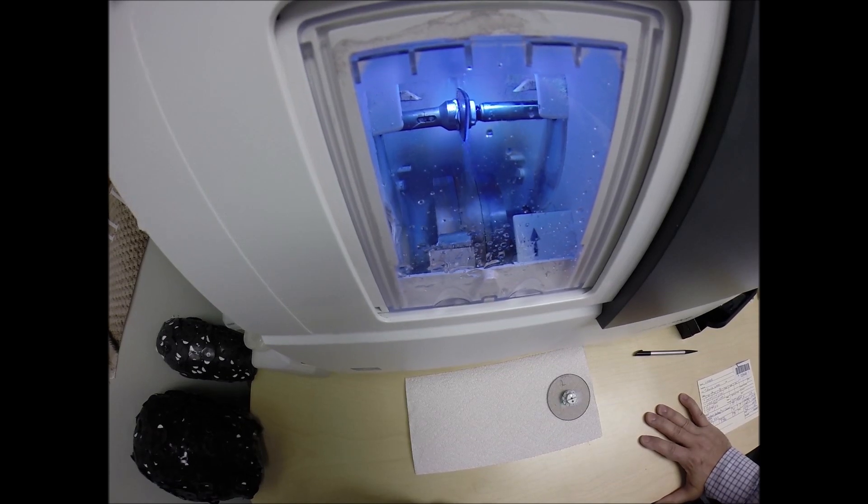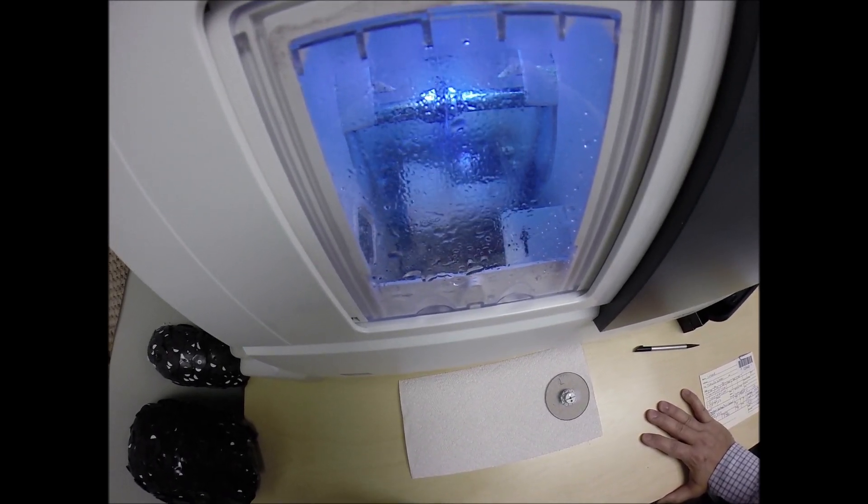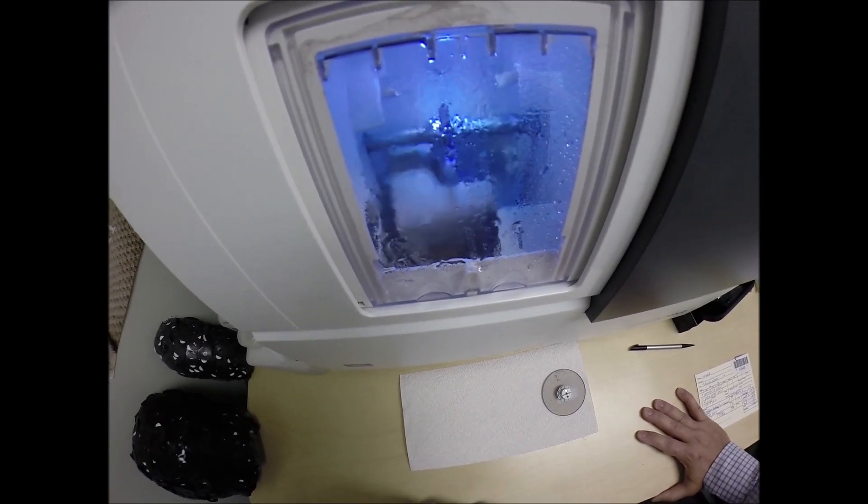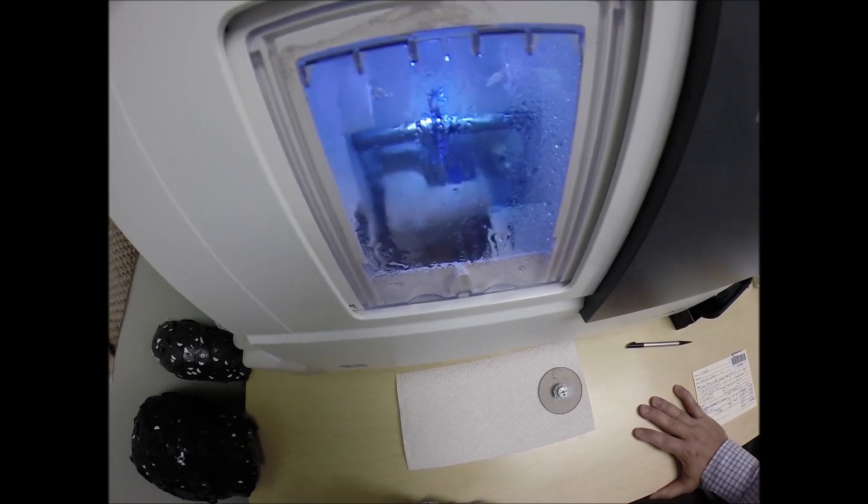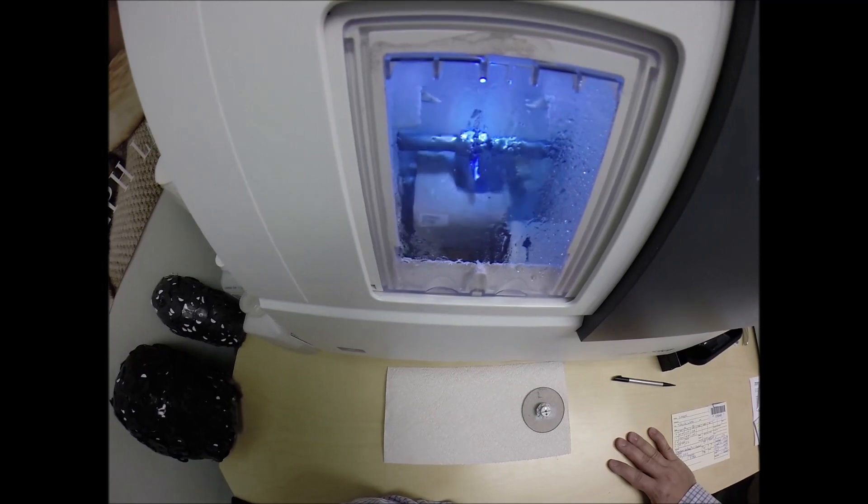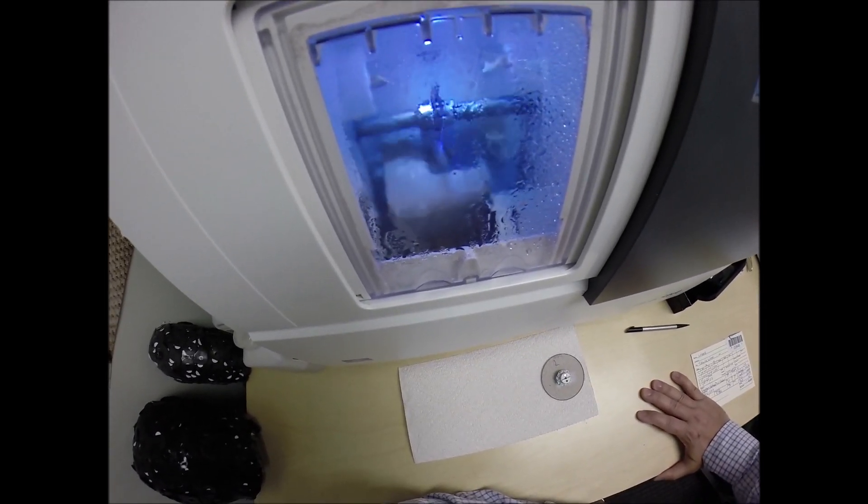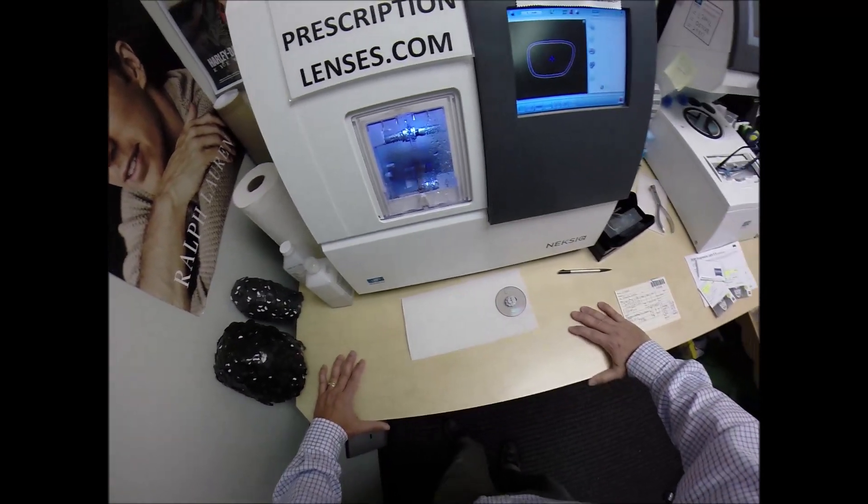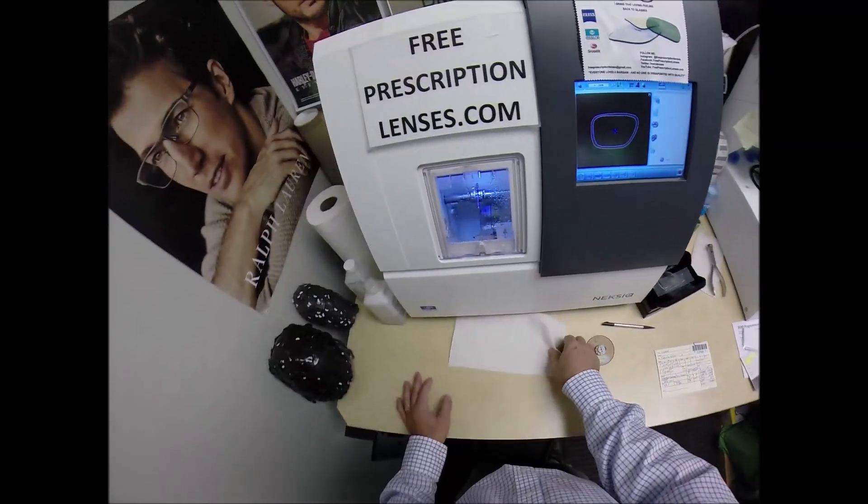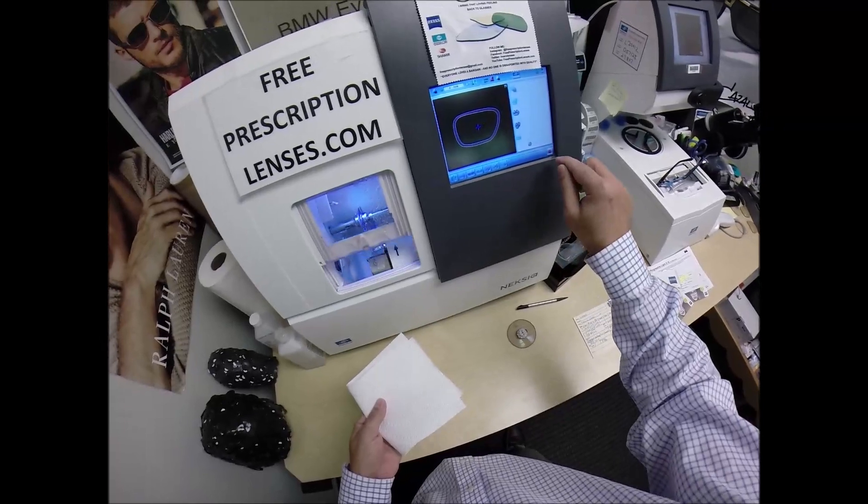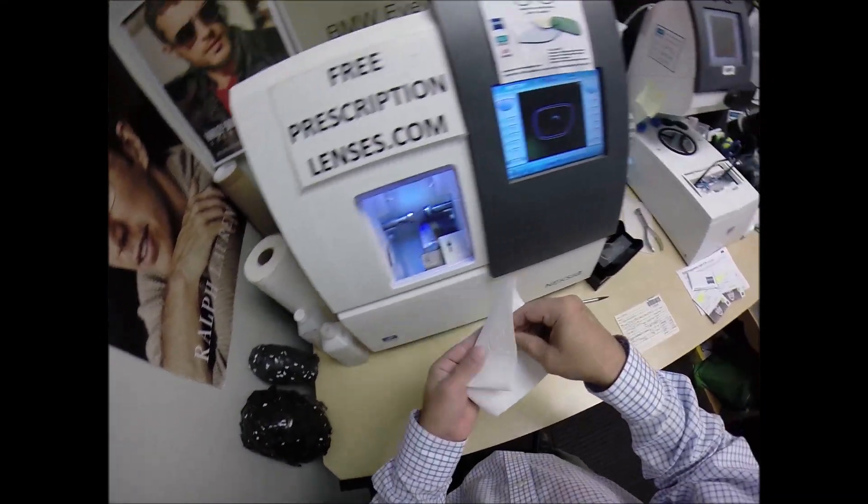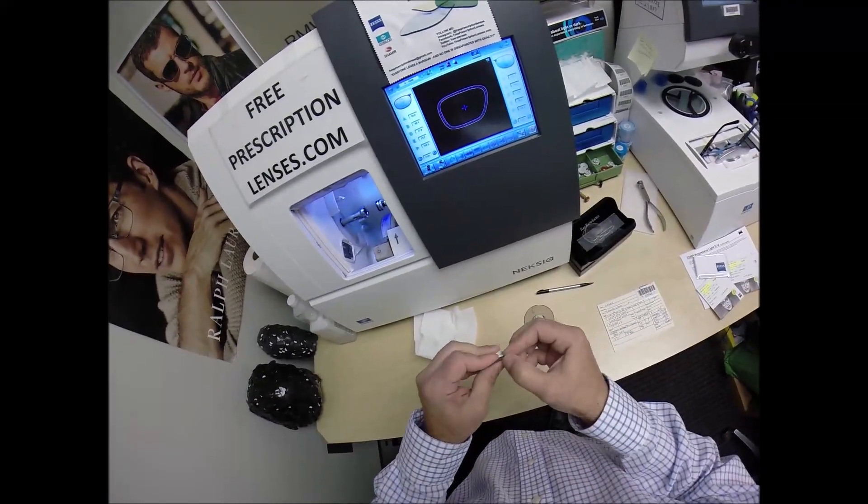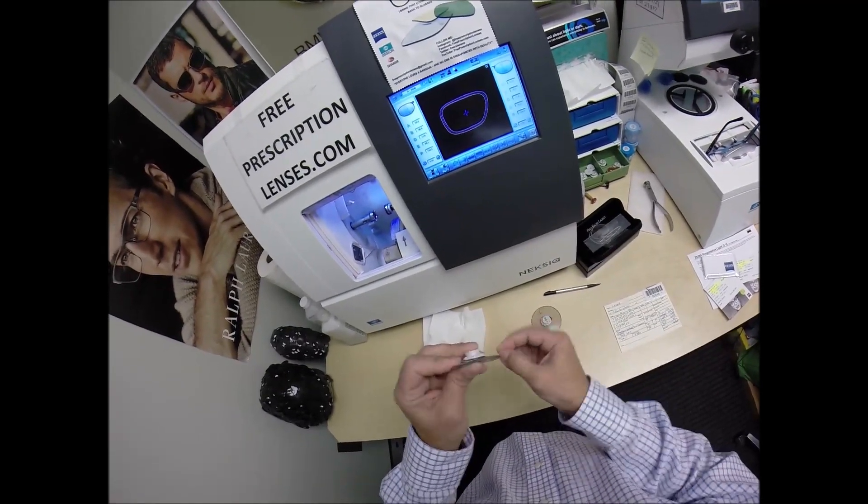Now the anti-glare coating has three features in one. The first feature reduces glare when driving at night, particularly driving at night in the rain with street lights, stop lights, computer screens to overhead fluorescent lights. It also goes by initials ARC which stands for anti-reflective coating so it reduces reflections when someone's looking at you. It makes for much better eye contact. They're not going to see the reflection of themselves in your lenses, plus if you take a selfie you're less likely to see the phone in your lens or if someone takes a picture with a flash you're less likely to see that. Plus it comes with the industry's hardest scratch coating. The machine that applies the anti-glare coating costs well over a million dollars. It takes over 24 hours to vaporize eight different coatings onto your lens so because of the time and the expense they put the industry's hardest scratch coating on there to protect their time and investment.